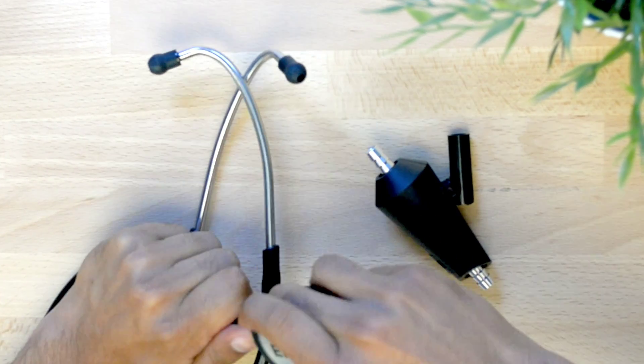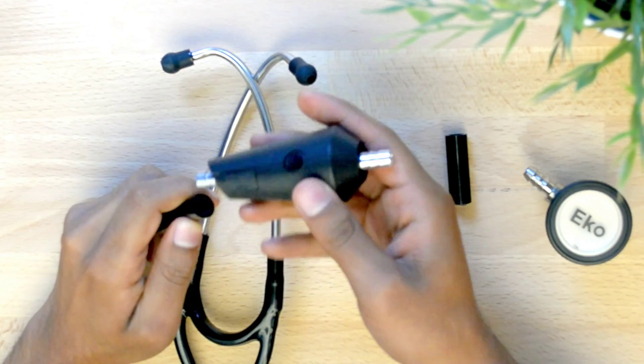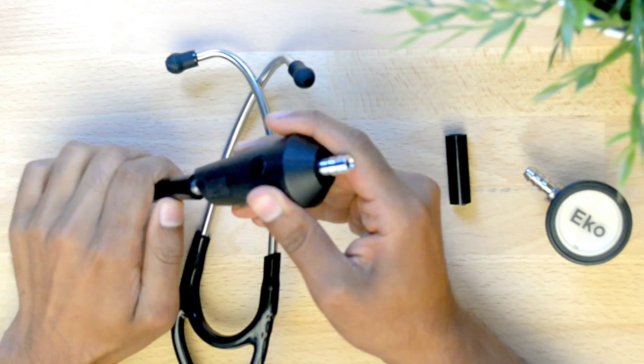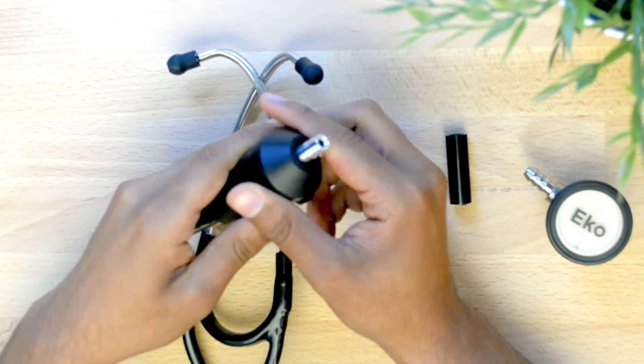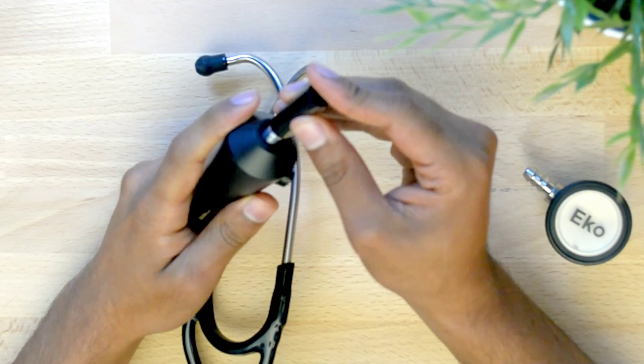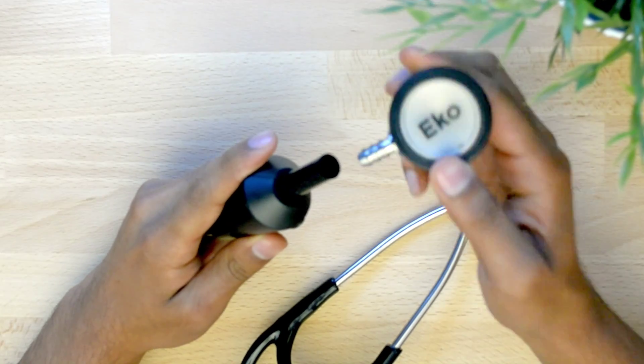First, remove the chest piece of the stethoscope. Insert the small end of the ECHO-Core hardware into the tubing of the stethoscope. Then attach the large adapter to the top of the ECHO-Core. Finally, insert the chest piece.